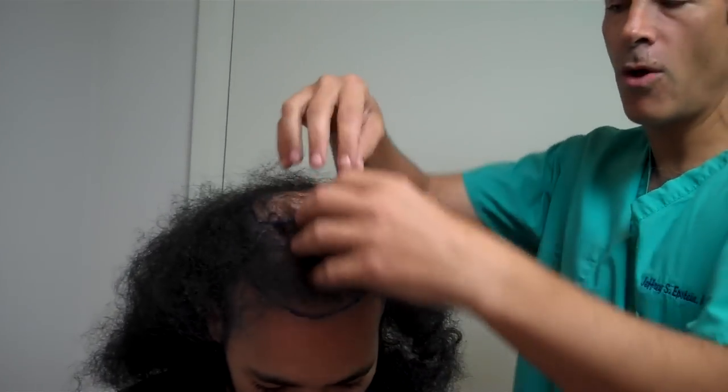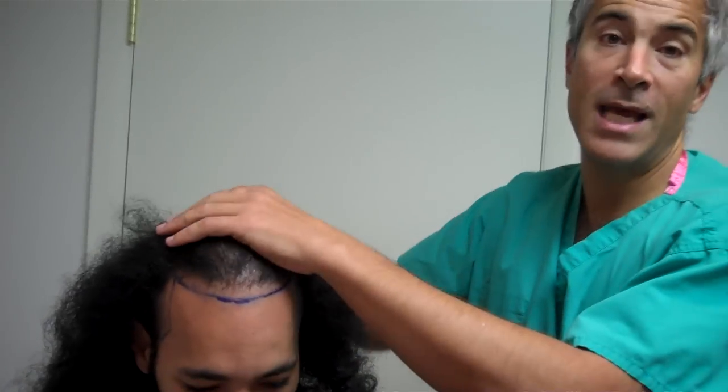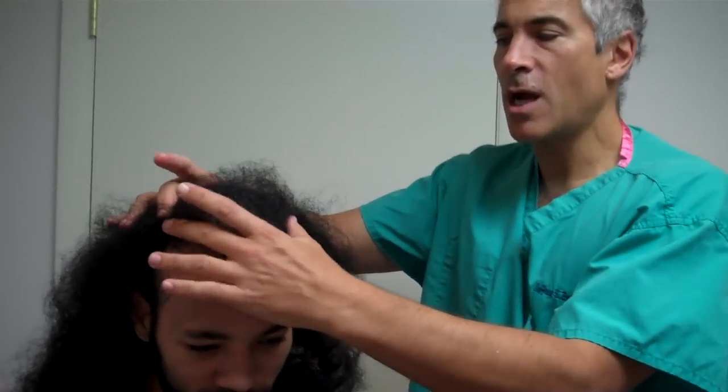We're going to go ahead and fill in, go all the way back to the crown area, and basically restore the entire top of the head as much as we can. Because we want to cover a relatively wide area, we're going to place some grafts in the crown, some up front, and obviously in the frontal scalp, and then along the hairline.